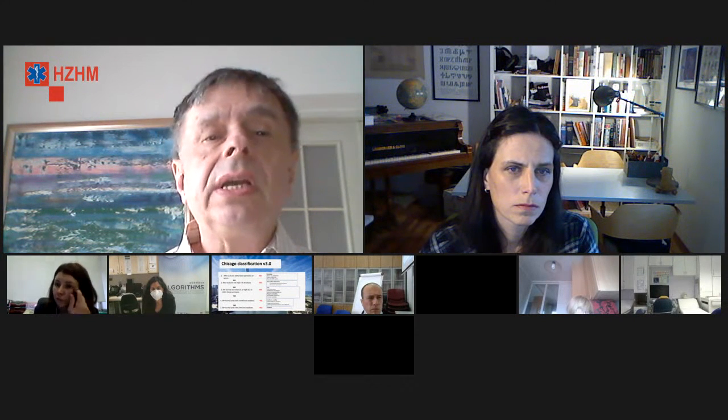Ako vam je računalo pokazalo da su neki od događaja nesuvisli, a ne uklapa se u ostalo, dakle on bi ipak bio za uzeti u obzir. Međutim, ako vam se svi događaji kada ih uzmete pokažu neupotrebljivima, onda je ipak neka greška bila. Ali može se desiti da jedan događaj bitno mijenja situaciju, onda taj događaj idete analizirati i vidjeti je li on stvarno promijenio, usporedite s klinikom ili ne. Evo, to je princip po kojem radim.